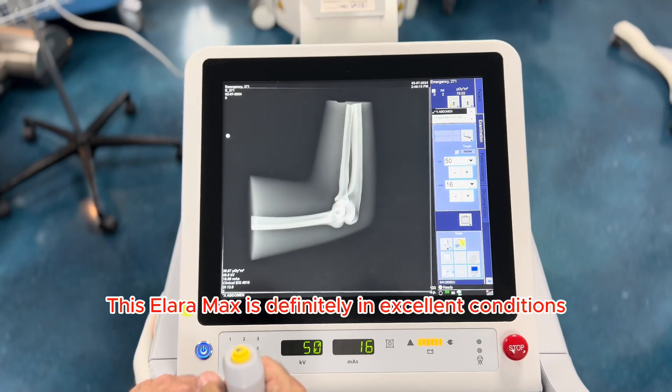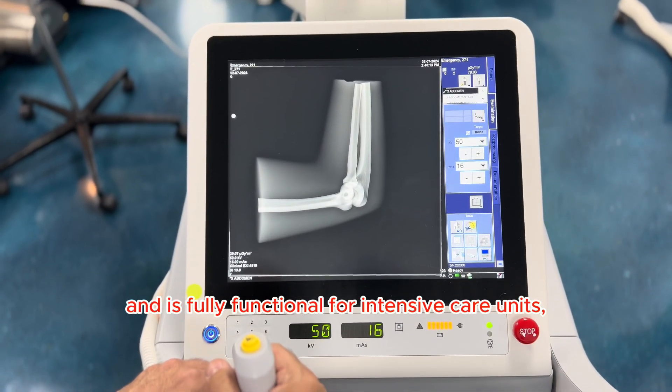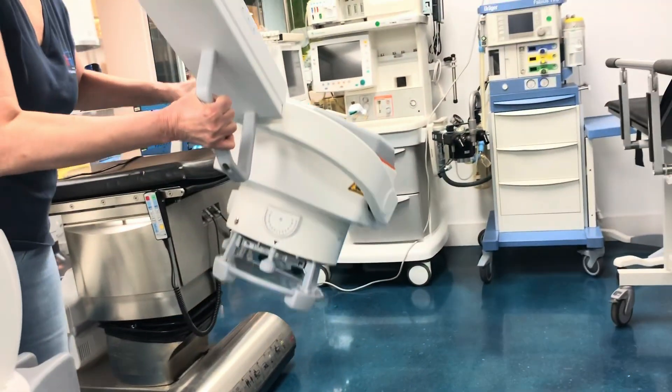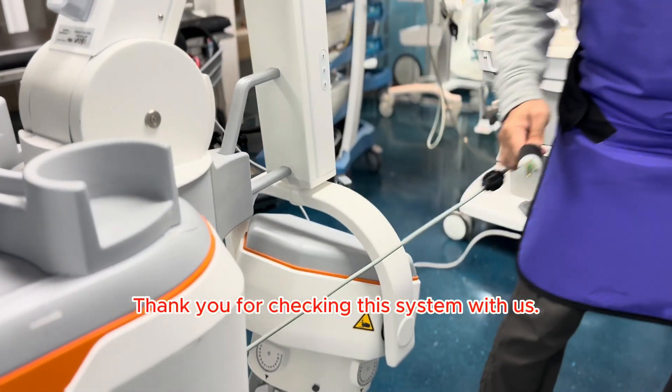This Elara Max is definitely in excellent condition and is fully functional for intensive care units, neonatal care units, and beyond. Thank you for checking this system with us.